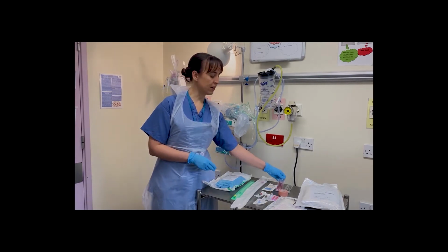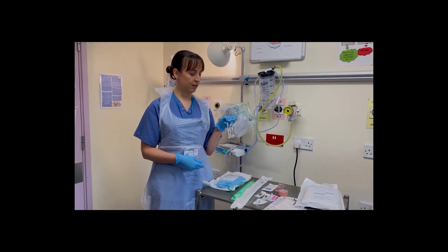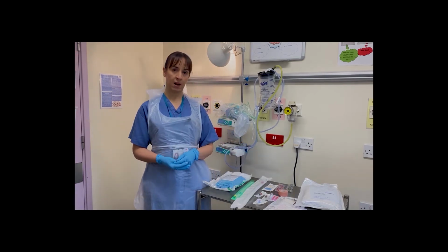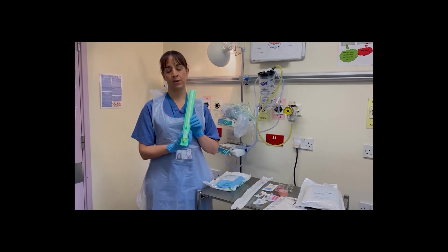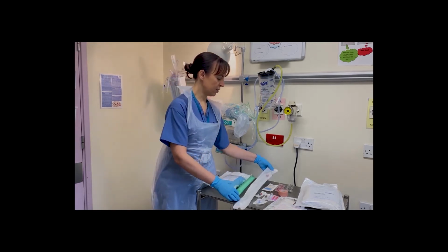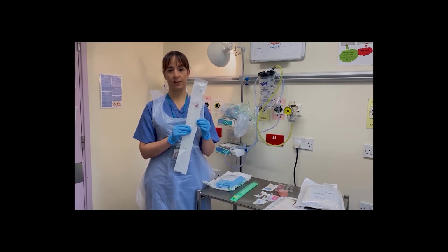And remember, with a preterm baby, you also need some sterile water to help clean the solution off so it doesn't burn the baby's skin. You also need the umbilical lines themselves. So the UVC, you'll note that this is a double lumen and it only comes in one size. The UAC is a single lumen and this comes in different sizes.